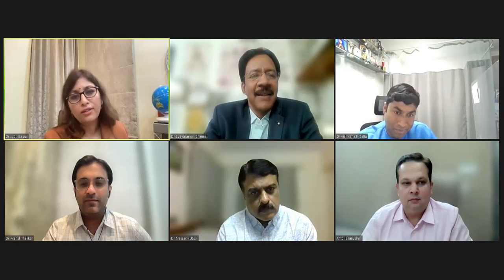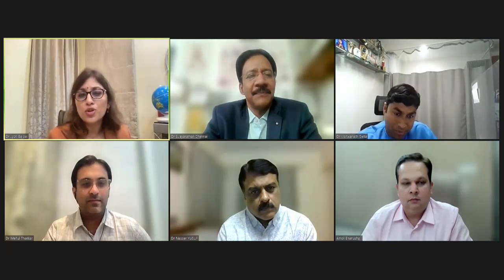One take-home message from my side: early intervention in grade 3 or class 3 empyema is key to success. And for cryobiopsy, it is a very important tool, and most of them are doing semi-rigid medical thoracoscopy. So I think we have to explore other options, and we have to explore more regarding cryobiopsy. Everybody has cryobiopsy for airway disorders, but in pleural disorders, the role is very minimal, but data is very robust and coming out nowadays. So we have to explore more in cryobiopsy, in medical thoracoscopy as well.